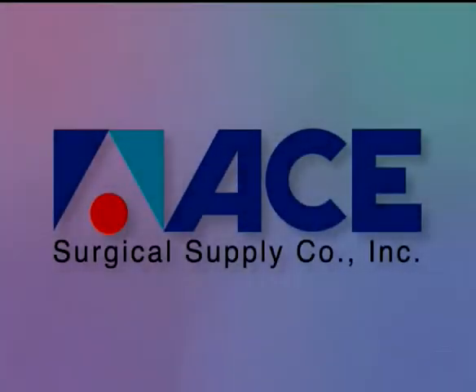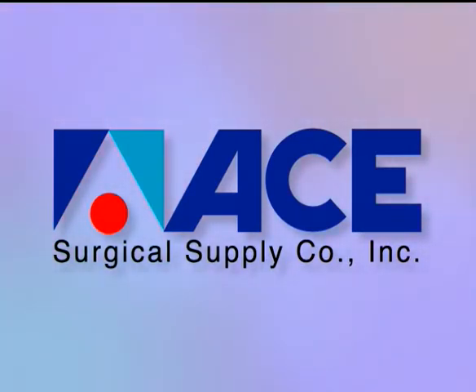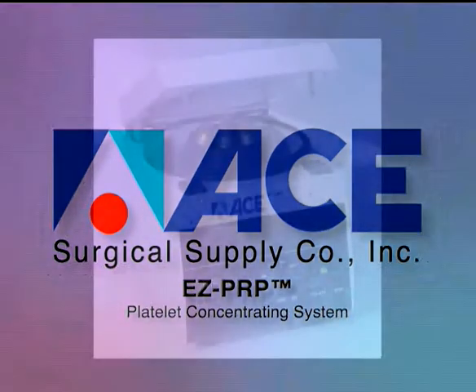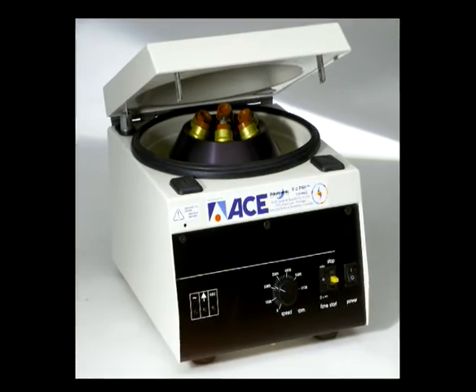This video presentation highlights the procedural steps in the use of the ACE Surgical Easy PRP platelet concentration system. In a little over 20 minutes in a lab setting, it permits the production of platelet concentrate from a small sample of blood and a general purpose centrifuge.